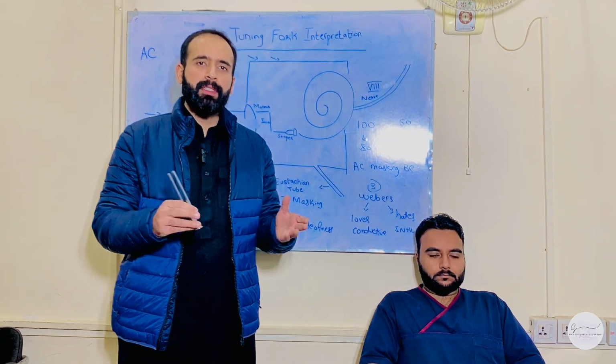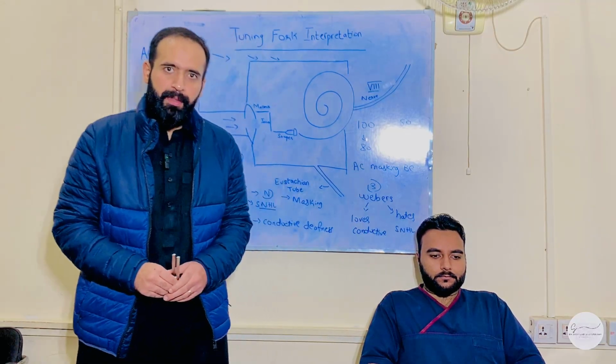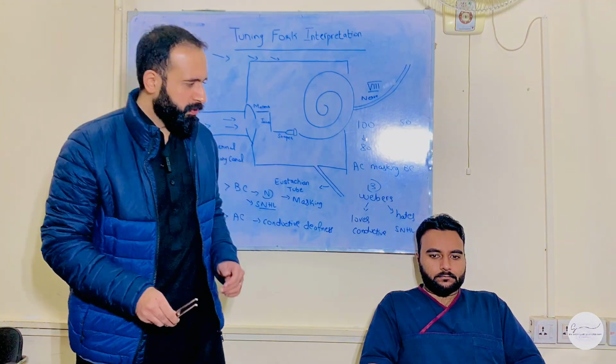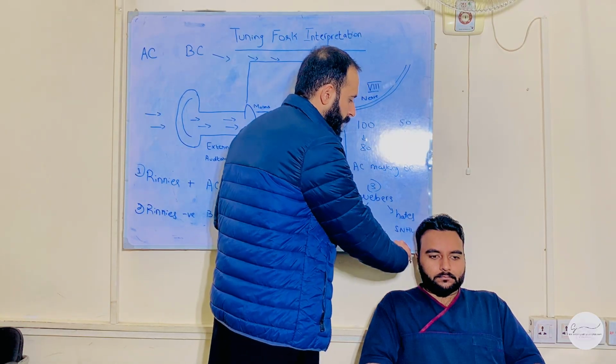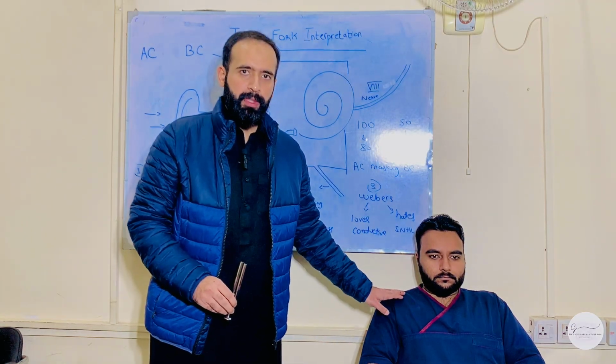This means that both ears have conductive deafness, but right has more conductive deafness. Coming towards the fifth scenario, let's say I am doing the tuning fork. I hold it in here on the right side. Patients say they can hear it in the front, but they cannot hear well at the back, which means that the air conduction is better than bone conduction.